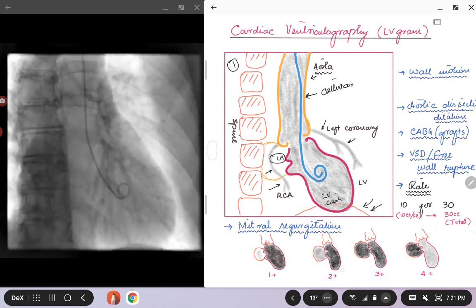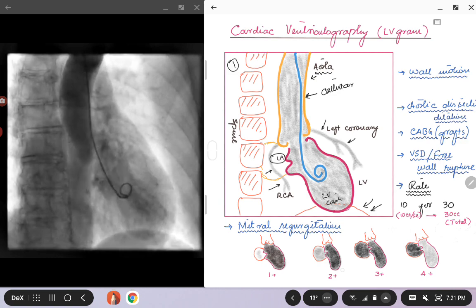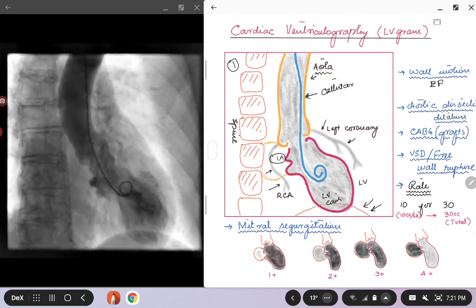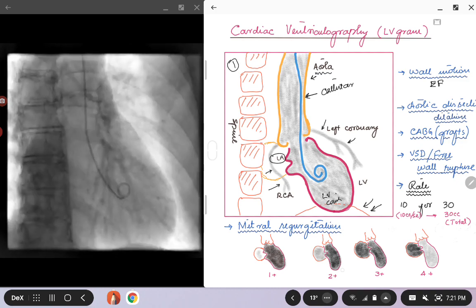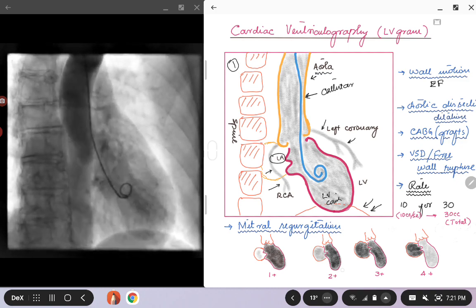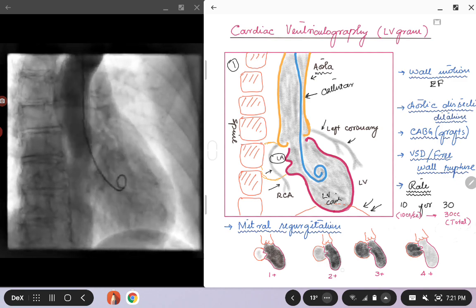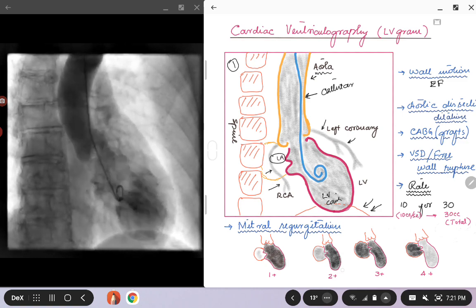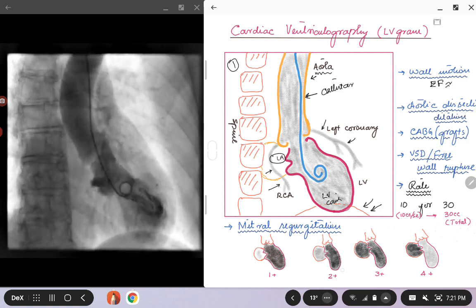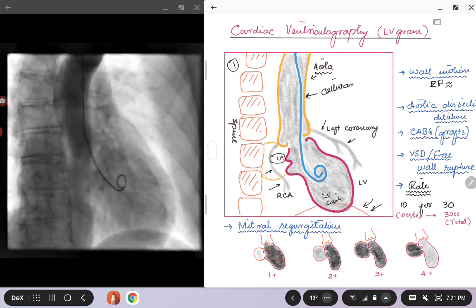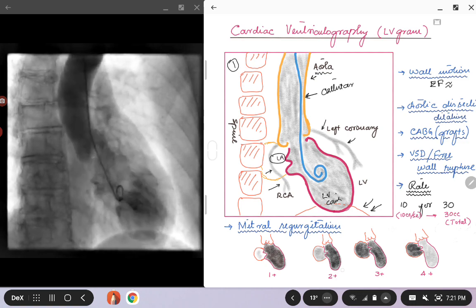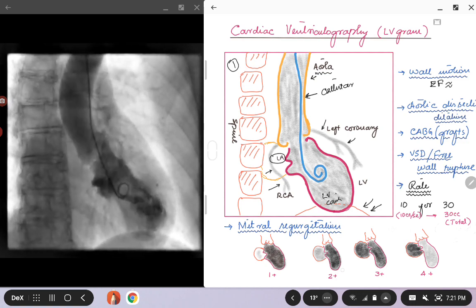Let's go step by step through what information we can get from the left ventriculogram. You might all be aware that we can estimate the ejection fraction or identify wall motion abnormality. If a patient comes in with an MI and you're not sure which is the culprit coronary artery lesion, you can see the wall motion abnormality by doing the LVgram. You can roughly estimate the ejection fraction and see what the LVEDP is, which will help you take care of the patient more quickly than waiting on an echocardiogram or cardiac MRI.